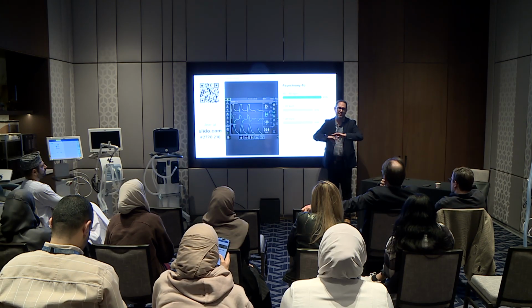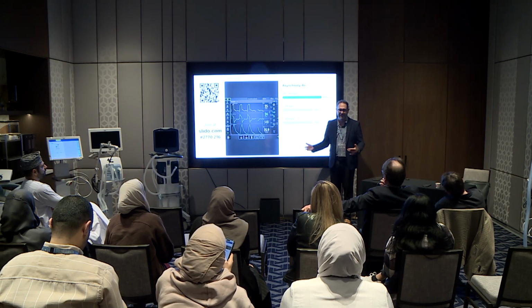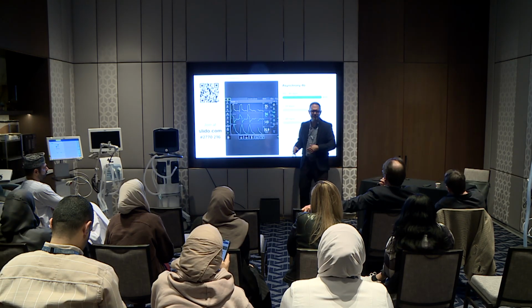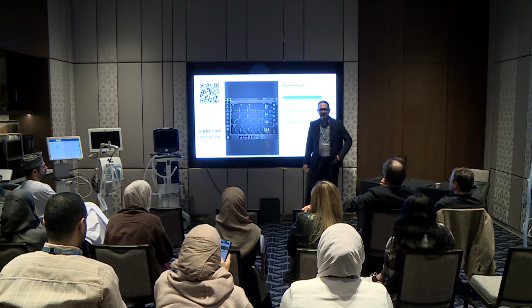I can't tell you that. That's a decision for the team. But this patient is clearly not weaning, like they're not tolerating ventilation as well as we think they are. Breathing 24 with good high volumes, like, oh, let's wean them. So you know what sometimes happens?